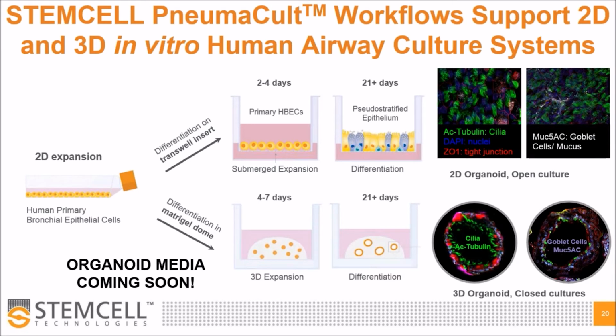These organoids show the differentiation of cilia that protrude to the apical side of the epithelia, and they are also able to differentiate goblet cells. These stainings show really well how this platform mimics in vivo systems.